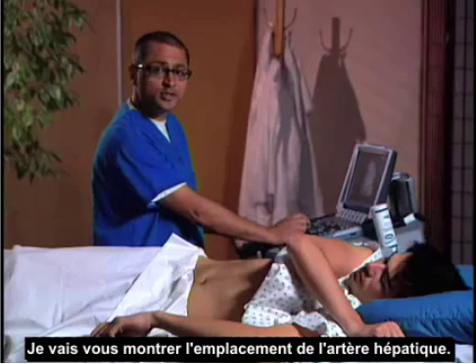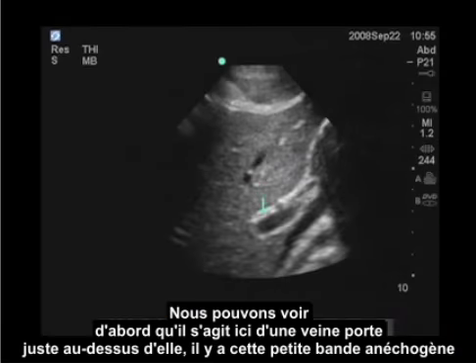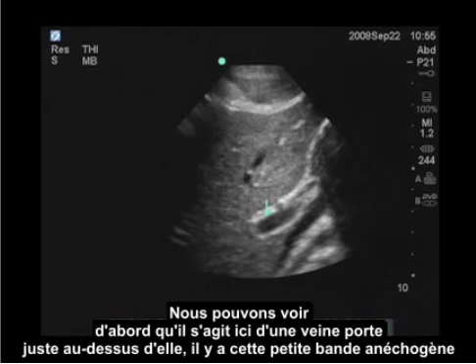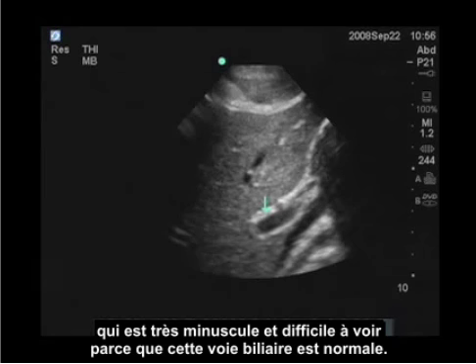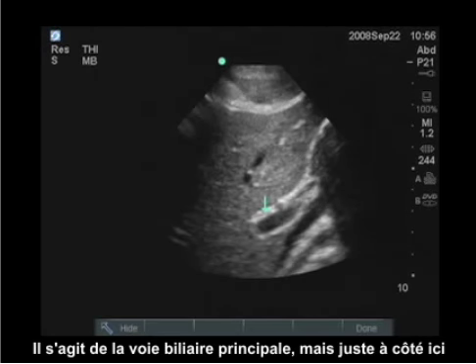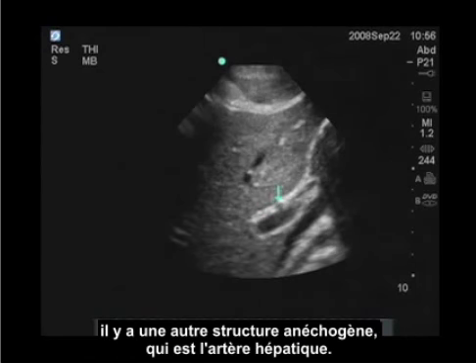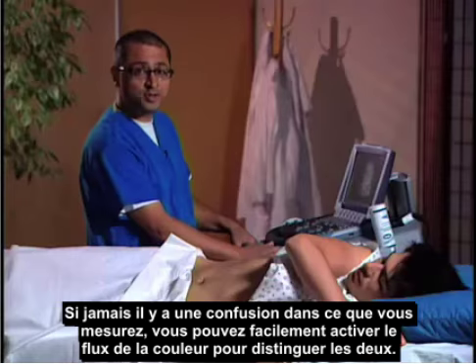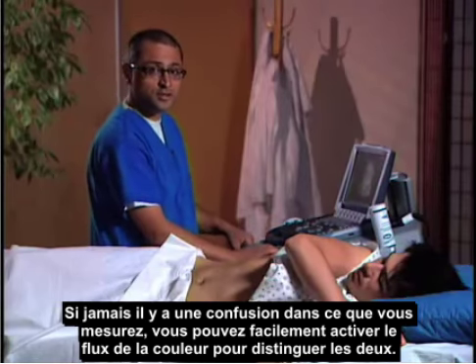I'm going to illustrate where the hepatic artery is. This is the portal vein right here. Right above it is that little anechoic stripe, which is very tiny and difficult to see because this bile duct is normal — this is the common bile duct. Right adjacent to it is another anechoic structure, which is the hepatic artery. If there's ever any confusion about what you're measuring, you can easily turn the color flow on to differentiate the two.